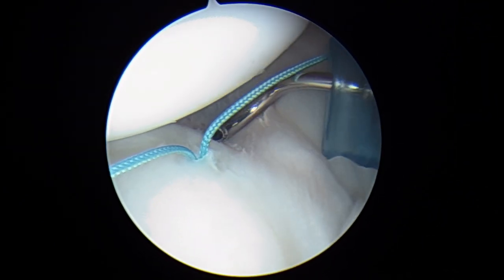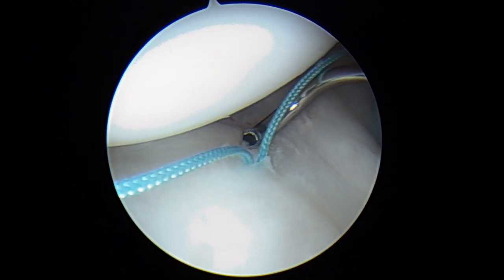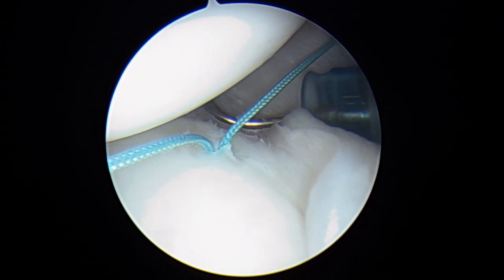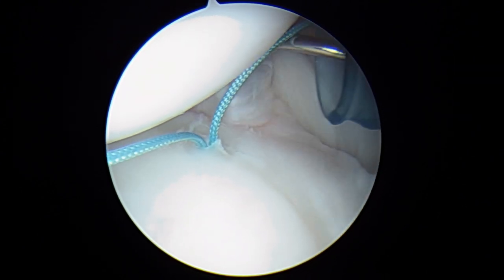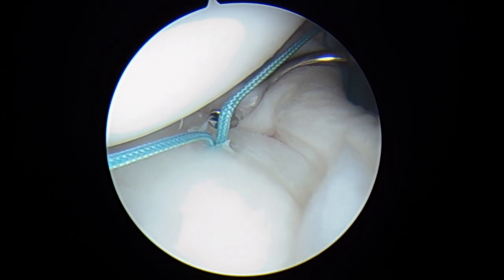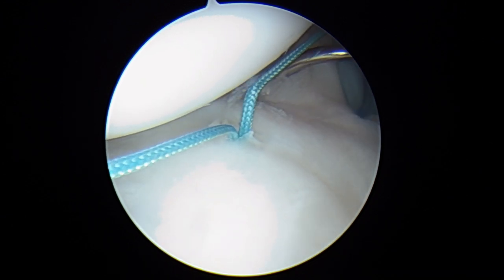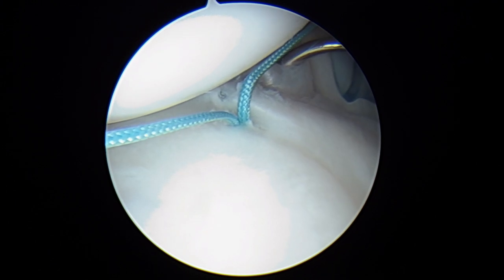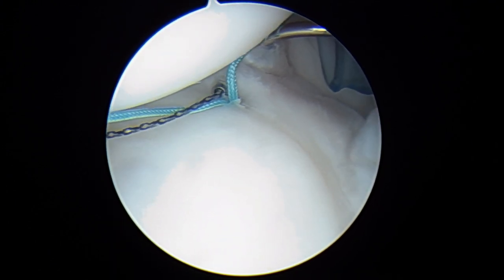We've got our suture hook in position. This is the posterior band of the inferior glenohumeral ligament — we want to end up about here. So we're going to start with our hook here, rotate our hand back, do a little bit of a shift, go into the capsule here, and there we get a good bite of the ligament. We bring that through the labrum and feed the relay through.